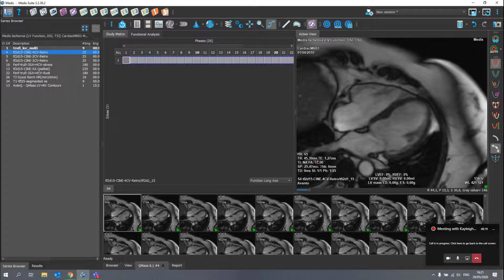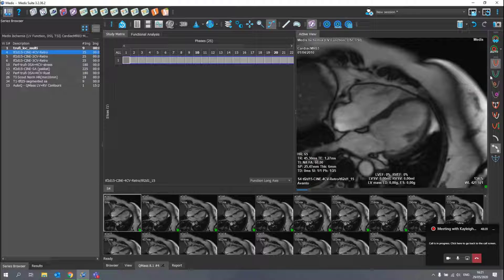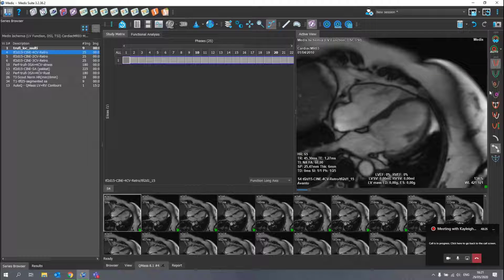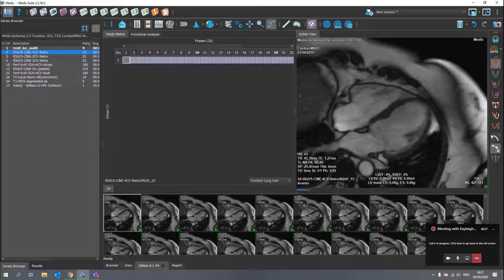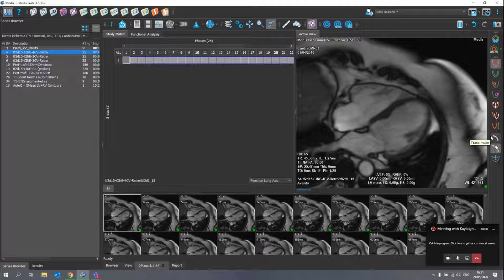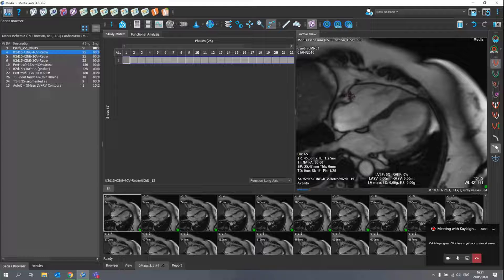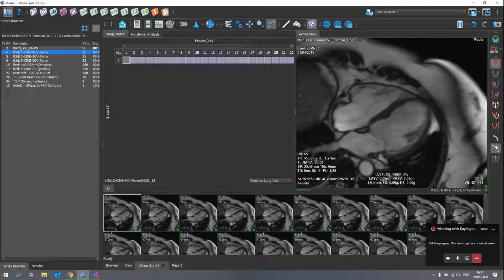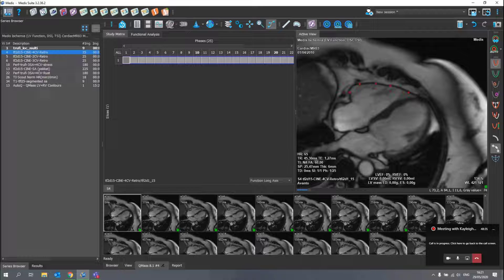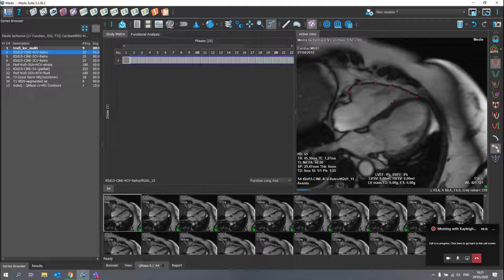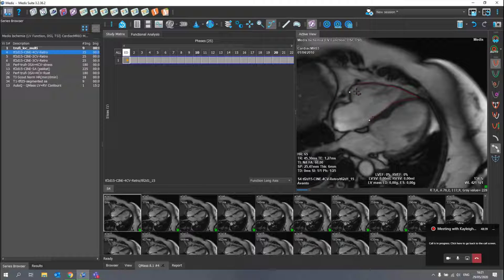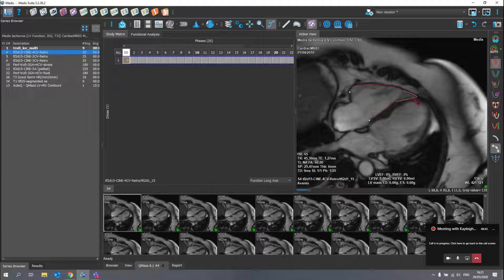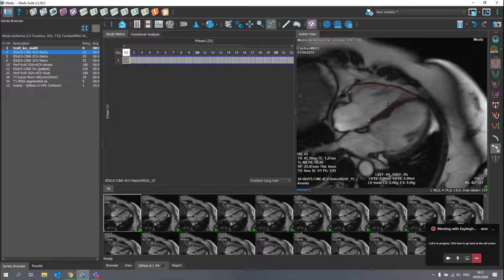I will make now the contours here with the endocardial contour tool, which is originally meant for the left ventricle. I can use either the freehand drawing or the point mode. Personally, I prefer the point mode, but completely up to you how to trace those contours. So we'll basically misuse here the left ventricle tool.